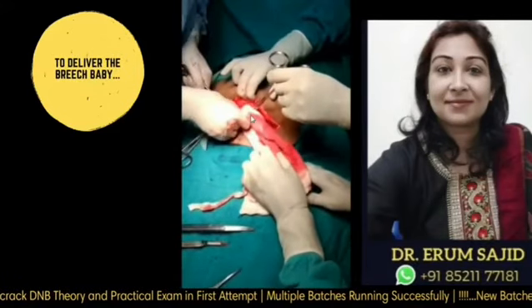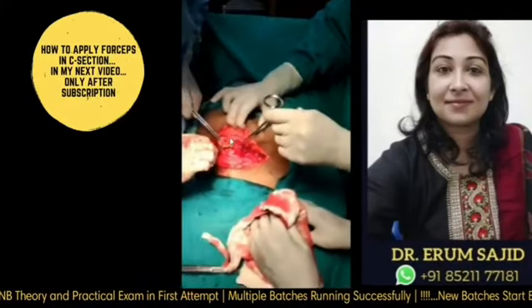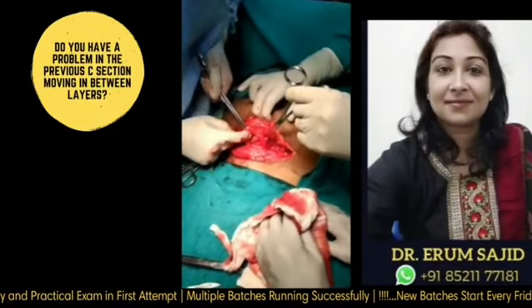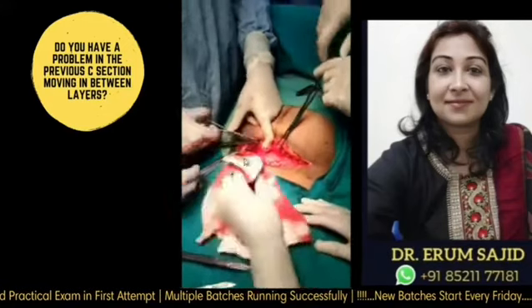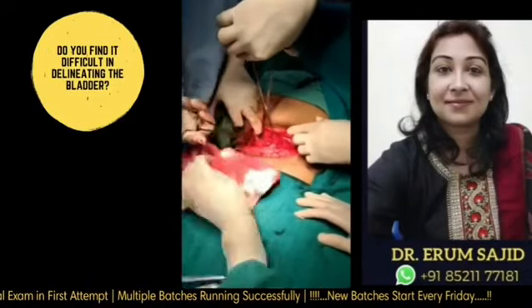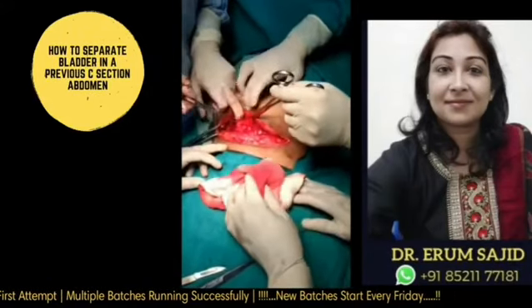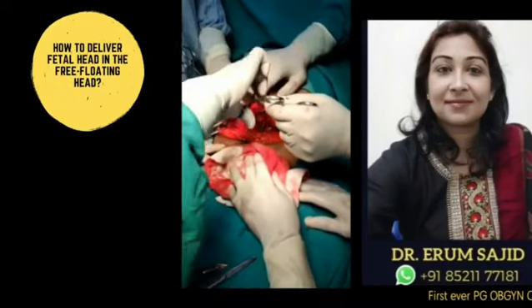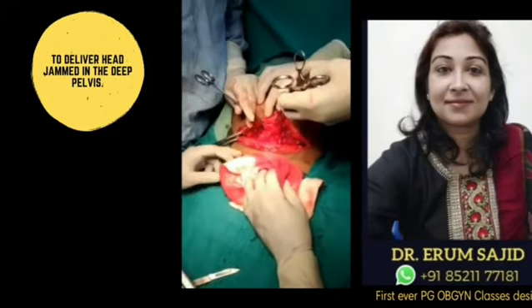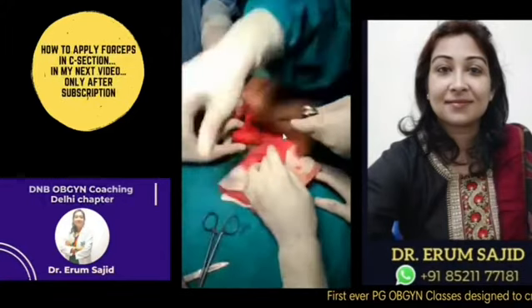I'm trying to make space for me to find a clean spot to enter the abdomen here. It's smudged, it's totally smudged. Everything is like, the peritoneum is stuck onto the rectus, to the muscle, to the rectus sheath, everything. And finally, a very small window I've got over here where I could see a clear peritoneum. I could see that there is nothing underlying it. There is no gut, there is no bladder, there is no omentum. I finally found a very, very clean space, and I'm asking my assistant to hold it, and then I give a nick to find a window. And finally I got my window. See, this is the window. Beautiful. And this becomes my peephole to see inside the abdomen.